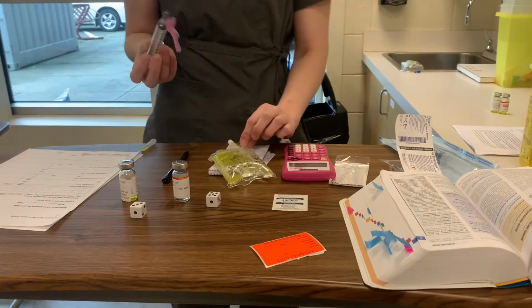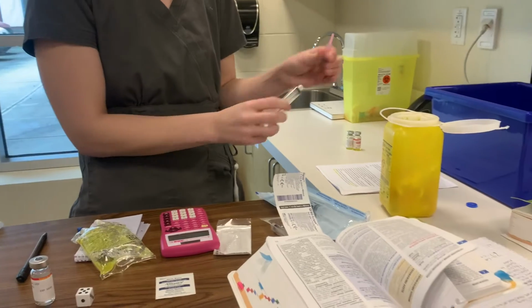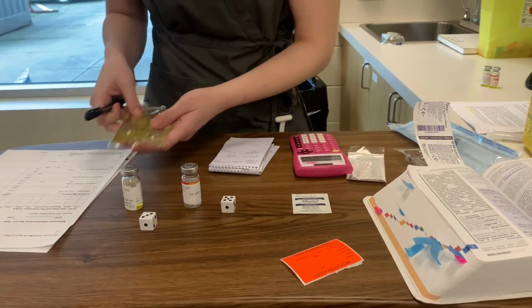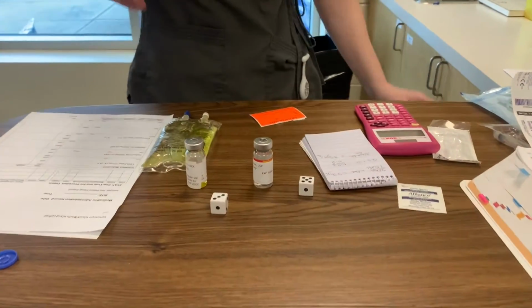So now that that's all good, I'm allowed to put that down. Just gonna take off my needle here and put it in the sharps. And then I'm just going to make a medication label here. This can go in the garbage as well.